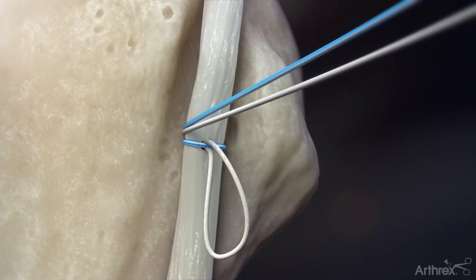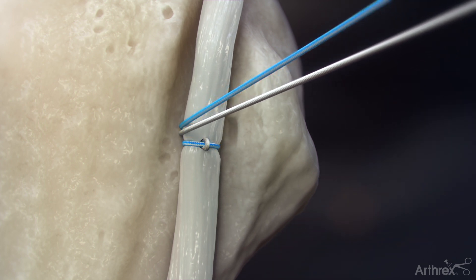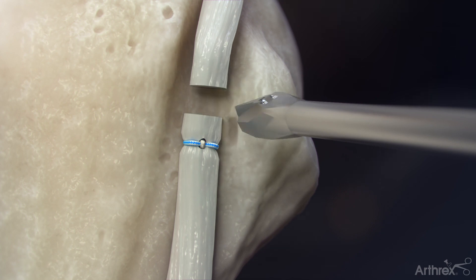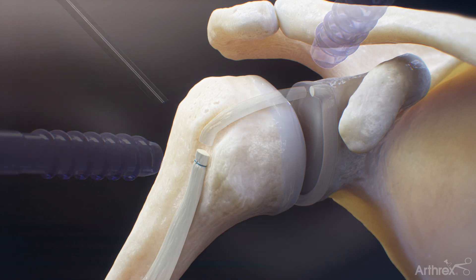Tension the white suture limb to lock the tendon to the blue circumferential stitch. Pull each suture limb sequentially to ensure adequate tension and a secure tendon reduction. Cut the suture limbs. Excise the biceps tendon 5-10 mm proximal to the repair and remove the remaining tendon stump from its attachment to complete the repair.